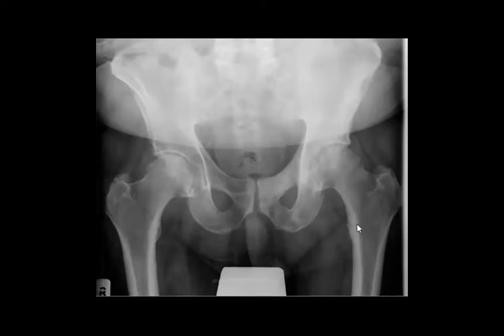I don't hear well, to be honest, Marwa. Doctor, what's the most common cause of these sclerotic lesions? For male, it will be the prostate, I think. But lung, you can put lung in everything, and breast. And for female, breast. Okay. Yes. Thank you very much. Okay, doctor. Thank you.